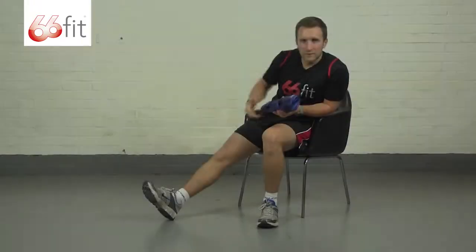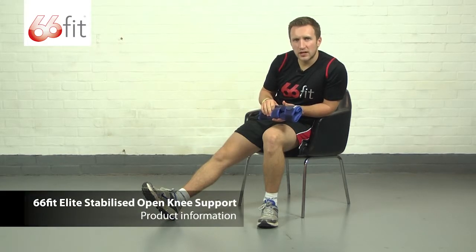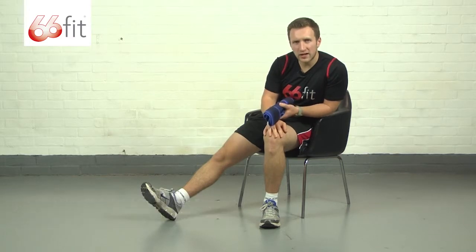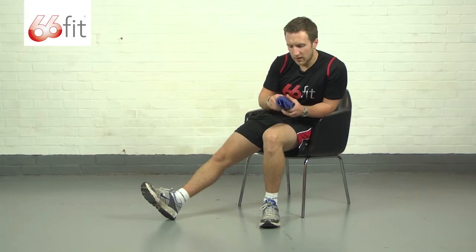I'm now going to show you in a bit more depth one of those supports. This is the 66 Fit Elite stabilised open knee support. It's made from a 100% breathable neoprene inner core and 100% nylon outer layer. It's nice and soft and smooth, so when you're wearing it against your skin you don't need to worry about things rubbing or irritating on the back of your knee.